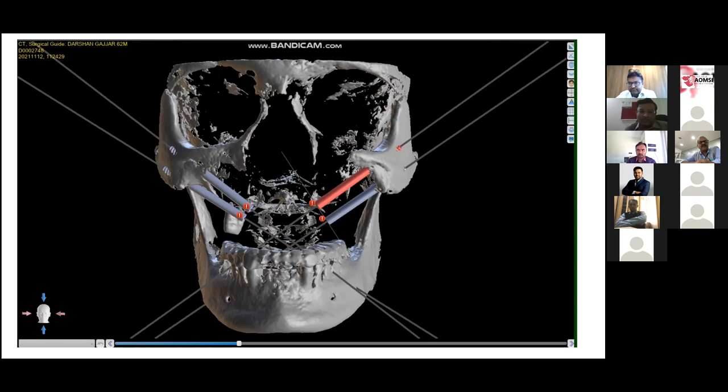Yes. In the long-term studies, we are still not aware of that. And in the case you showed, what we call a pin tract infection, the food lodgment, may lead to some infection around the implant and implant loosening later on.